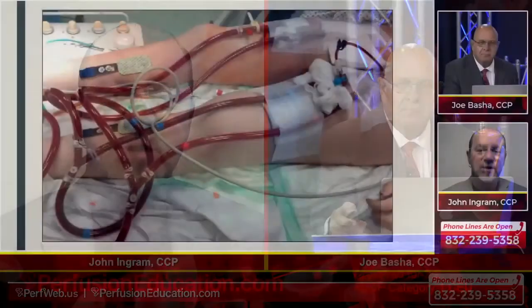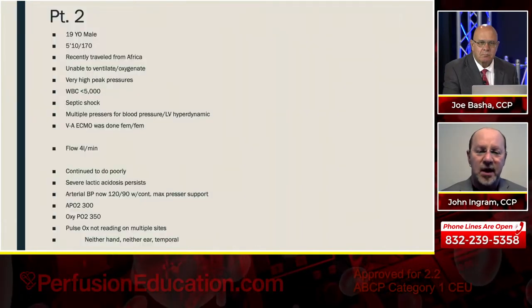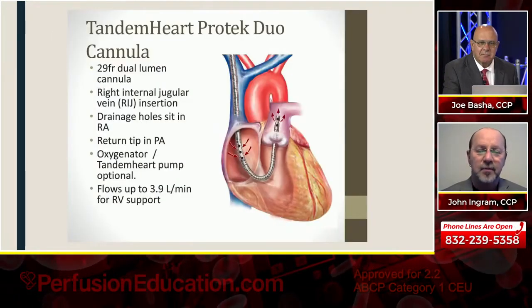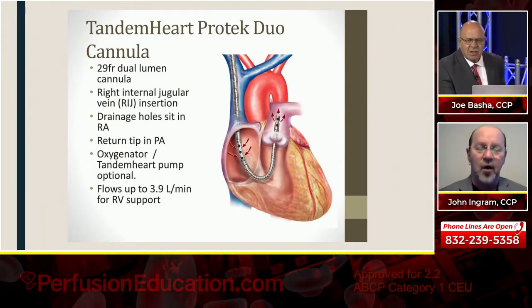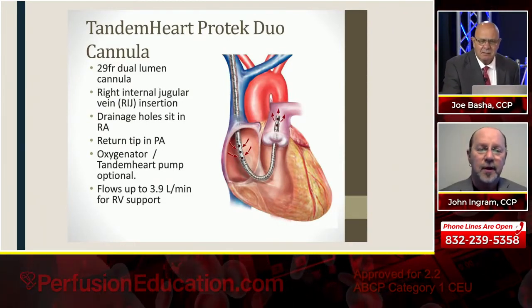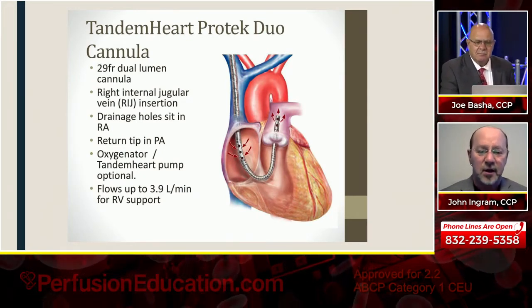So Joe, why don't you at least go back to that Protech Duo Cannula slide, because I felt the lecture today was basic ECMO to build a platform. Yes. Tomorrow, do you want me to send you this slide? Yeah, so this is the Protech Duo Cannula.